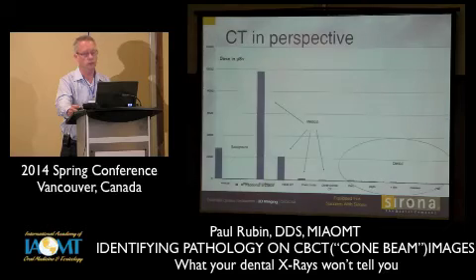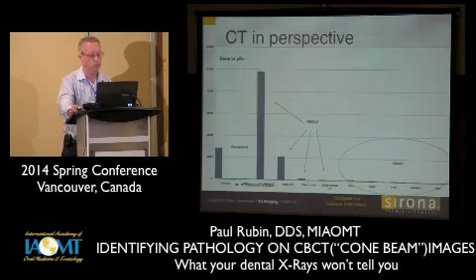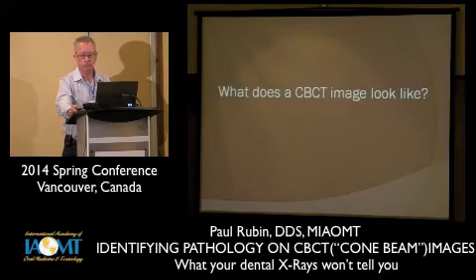Here's a chart from Sirona showing on the right that dental x-rays in general are very, very low compared to medical x-rays. The Galileos, I said, is 70 microsieverts. If you compare that to a head CAT scan, it's about 2,000 microsieverts. So let's put that part behind us.